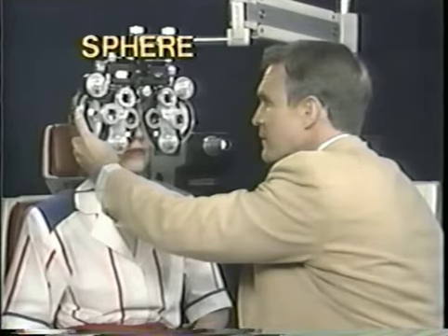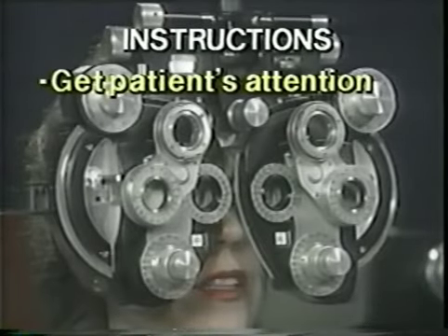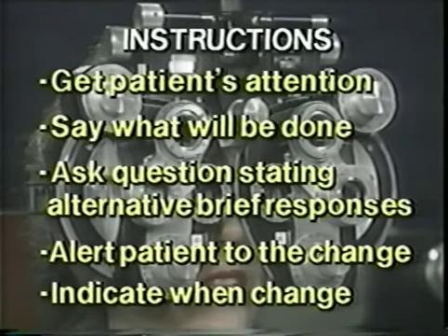Note that the instructions to the patient should follow a definite pattern and must be timed to the lens changes made. First, get the patient's attention. Say what will be done. Then ask the patient the appropriate question, stating alternative brief responses, such as, does this make it better or worse? Alert the patient to the change by saying, ready? Then say, there, as the change is made.